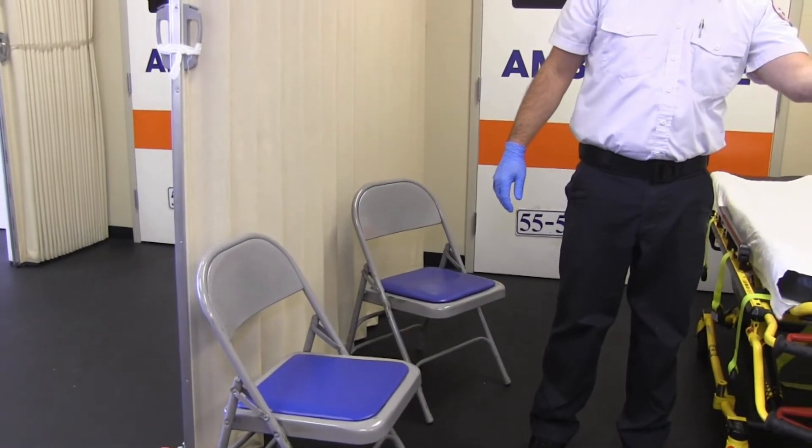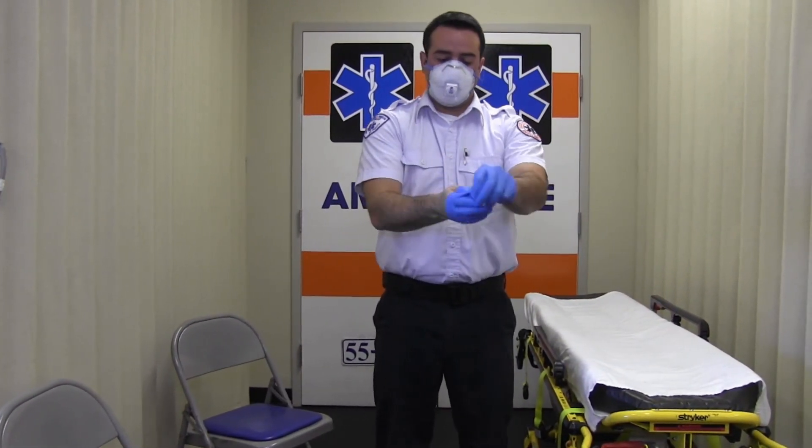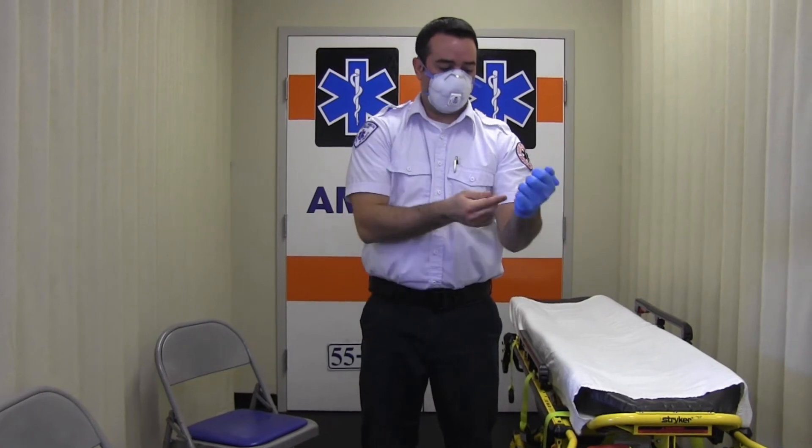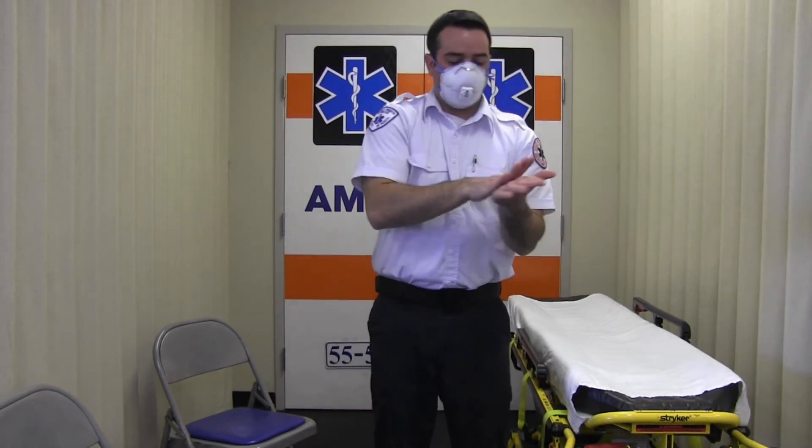Once you have removed your gown, you will then disinfect and change your inner gloves. Disinfect the inner gloves with an alcohol-based hand rub, remove, and discard the gloves, taking care not to contaminate your bare hands during the removal process. Perform hand hygiene with an alcohol-based hand rub prior to donning a new pair of gloves.